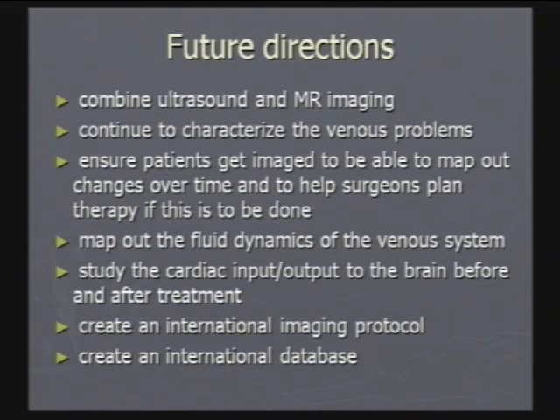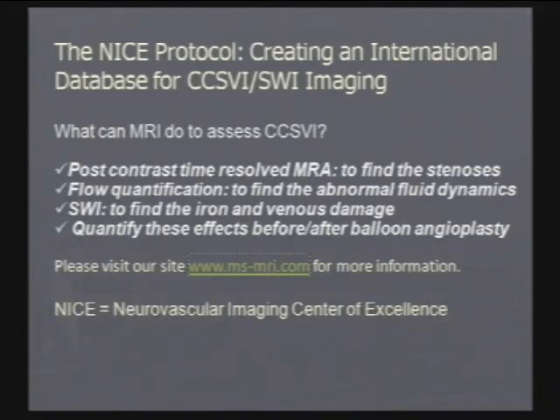And then I think it's important for us to create an international imaging protocol and an international database for us to use. And so along these lines, one of the things we'd like to see happen, and I think Sal has suggested it, and many other people are coming to this conclusion, is that it would be very nice for us to have some type of imaging database where people can send their data. We're going to need IRBs for this. But I think to characterize what's happening in MS is going to take thousands of cases for us to really understand it.